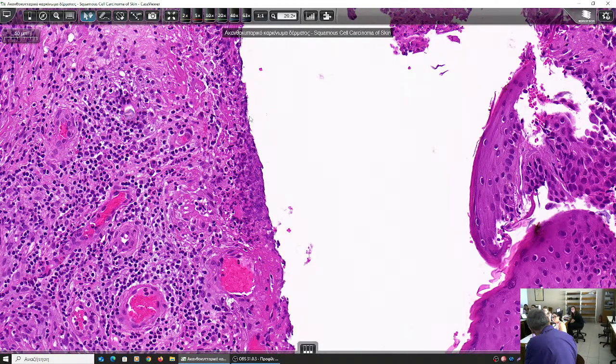How do you say that? No, that means it changes to another type of epithelium. That is metaplasia. That means we have an epithelium and it is not destroyed, but it changes to another type of differentiated tissue, but of another type. So what do we call this?